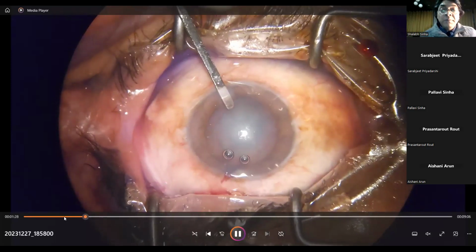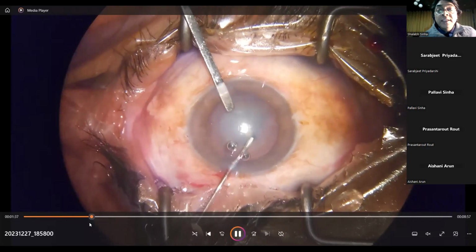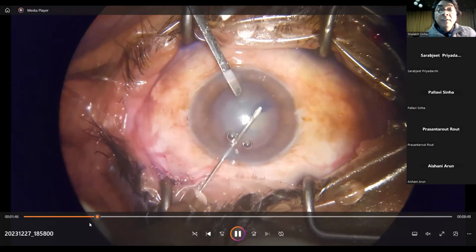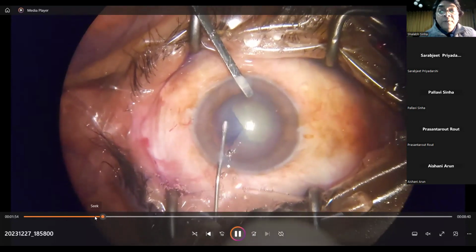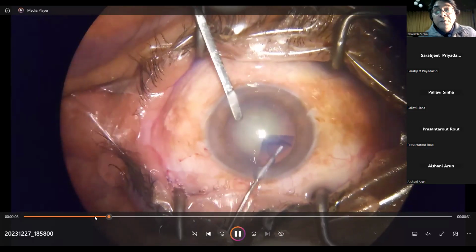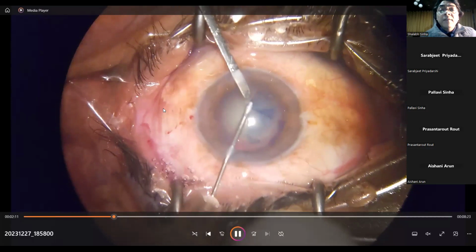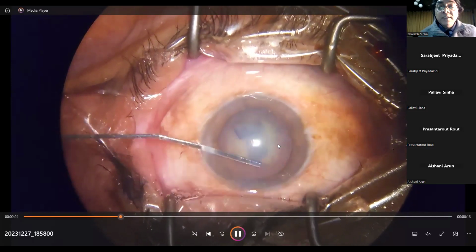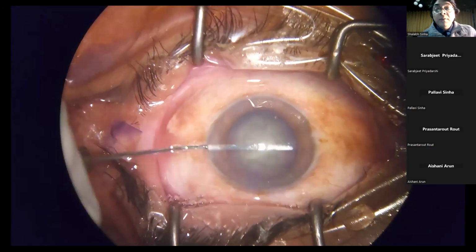This is a Gaurav Luthra marker. Just press it upon the cornea to give you somewhat of an approximation of the rhexis that you're going to do. So one must try and measure this every time so as to be very consistent with the size of the rhexis. Then what we do is that we raise a flap of the anterior capsule, then putting the flap flat on the surface of the lens, and following the mark that we have made on the cornea, we make a circular rhexis. So this is the most important step in phacoemulsification. You must have a central, circular, and a complete rhexis.